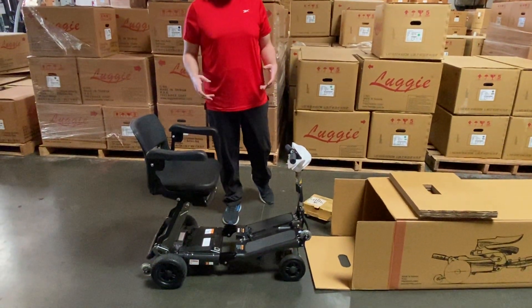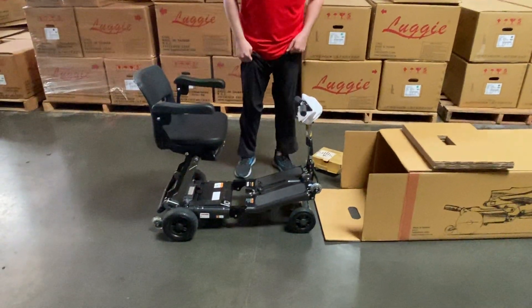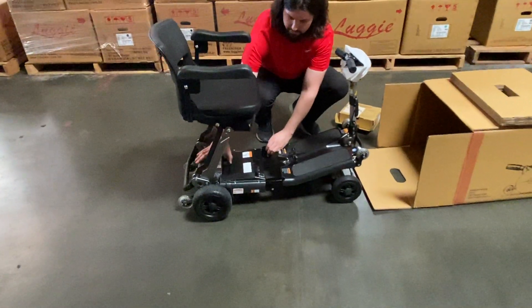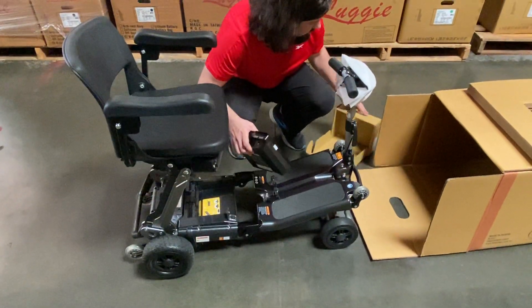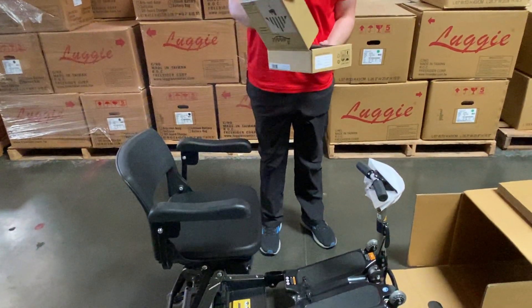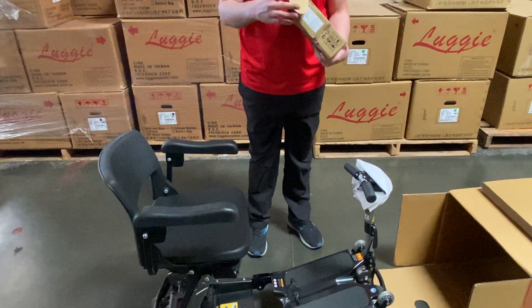We will be repacking our scooter just in case you ever need to send the scooter back to us for repairs. Start by taking out your battery. Make sure to hold on to your battery box so that way you can put your battery back in for easy shipping.